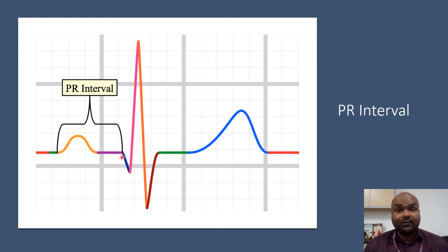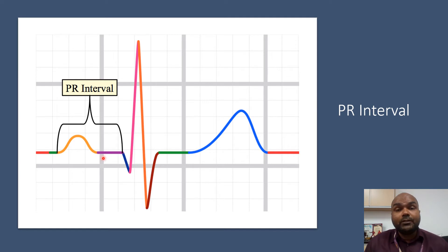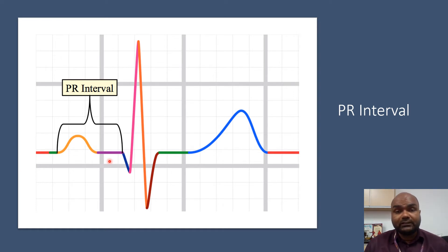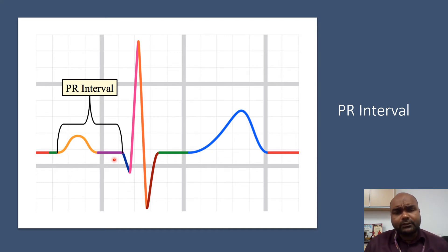Sometimes the PR interval may be shorter than three small boxes. This could be due to a pre-excitation syndrome, or conditions such as Wolff-Parkinson-White syndrome, where the conduction bypasses the AV node and goes through an accessory pathway to activate the ventricle.